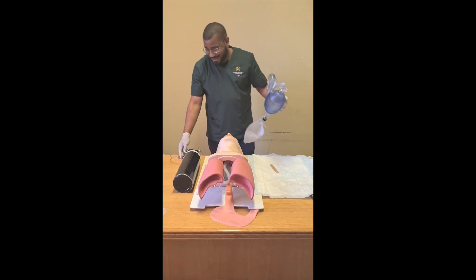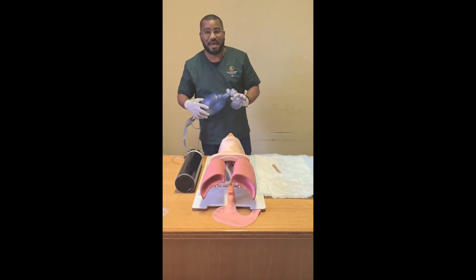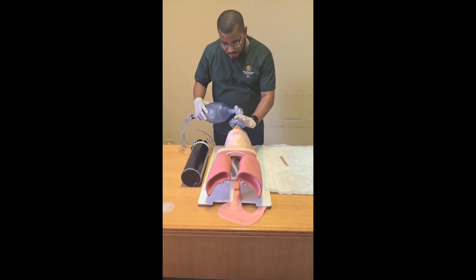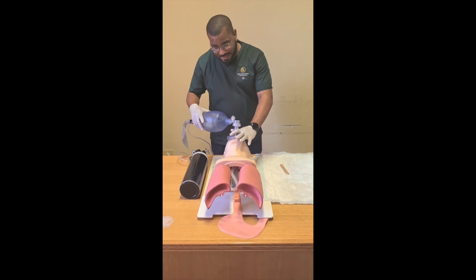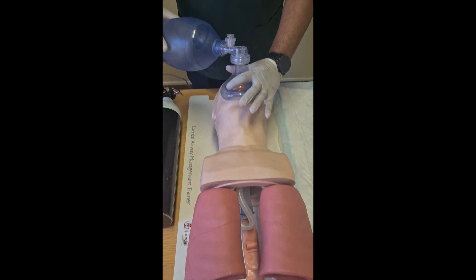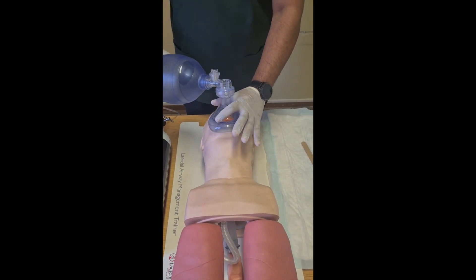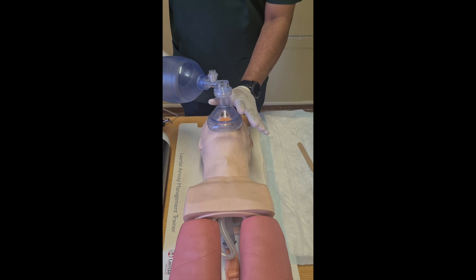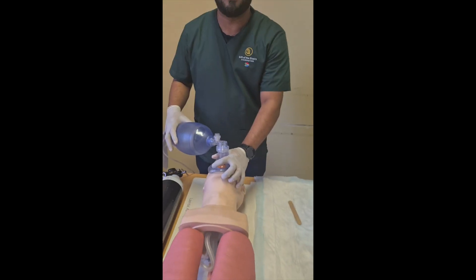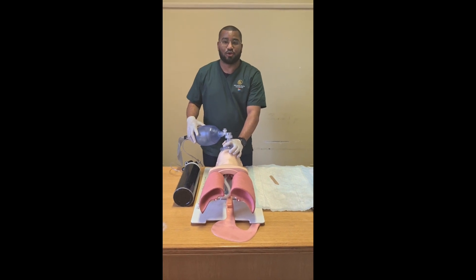With my regulator and flow rate set at 15 liters per minute, I will then apply the mask of the BVM to the patient by gently seating it over the bridge of the nose, making sure that I completely cover the nose as well as the mouth. In order to ensure a proper seal, I will use the EC clamp technique — the C as well as the E which goes according to the line of the mandible — and gently pull the jaw into the mask, creating a proper seal.